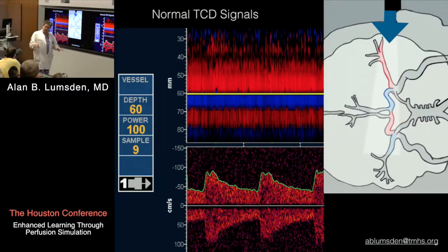I don't really give a damn about my legs. Although maybe, that's probably optimal. I worry a little bit about my kidneys. I only got 3 or 4 minutes of brain, and I would really like to know minute to minute what's going on in my head when I'm on cardiopulmonary bypass. Okay, and then we'll get to the embolization part basically a little bit down the line.